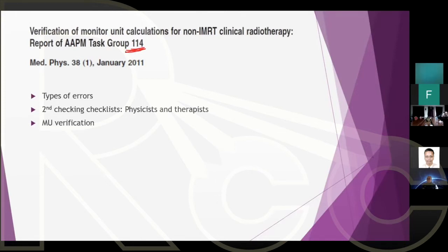And here's another question, everyone. What is the allowed tolerance or agreement? Let's put it this way. What is the allowed agreement that you expect between the planning system and your MU calculation? 1%, 2%, 3%, 5%? What do you think? Okay, so someone said less than 5%. Okay. Less than 5% for everything or for certain cases? And if I'm treating a non-Hodgkin's lymphoma, APPA, this very complicated beam with so much blocking, would I expect the same, 5%, 2% agreement compared to whole brain, for example?